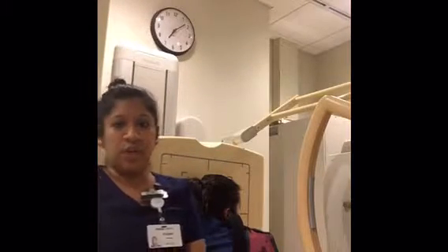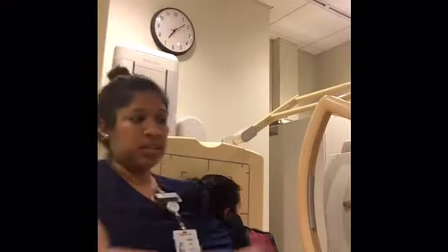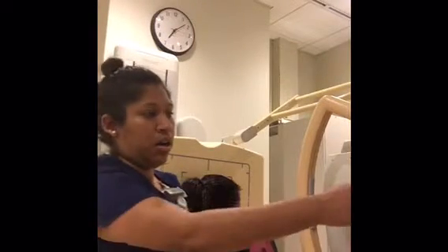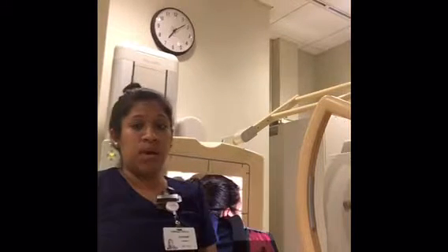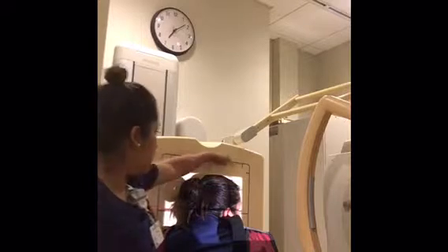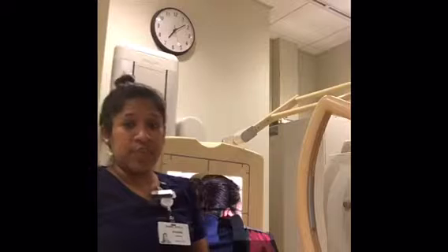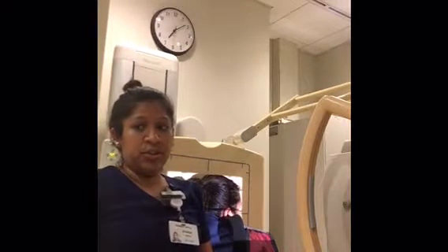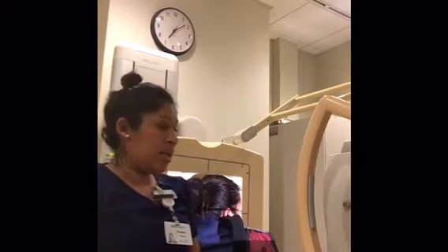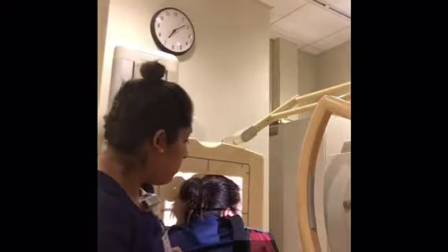Thank you. Okay, so now we are ready to shoot our first projection, which is the lateral projection. And we're going to start by our tube being detented to 40 inches, and we have our 10x12 cassette. So we see that it is 10x12, and it is crosswise for this projection. Our central ray enters perpendicular and enters 2 inches superior to the EAM. So here is our EAM, and it is 2 inches superior to that.